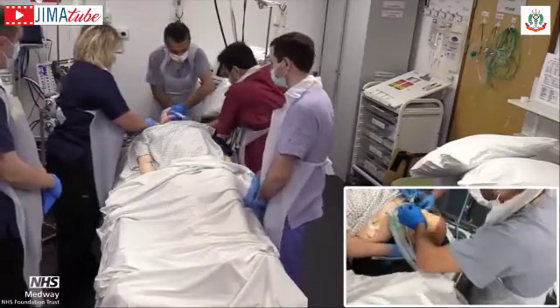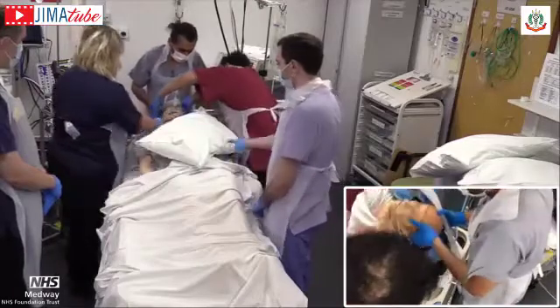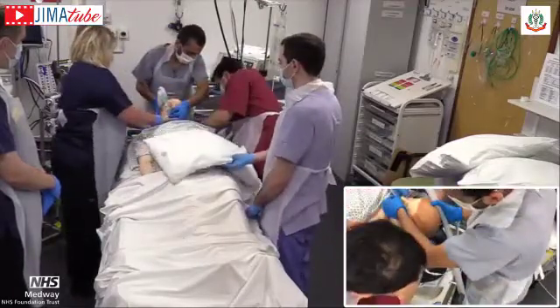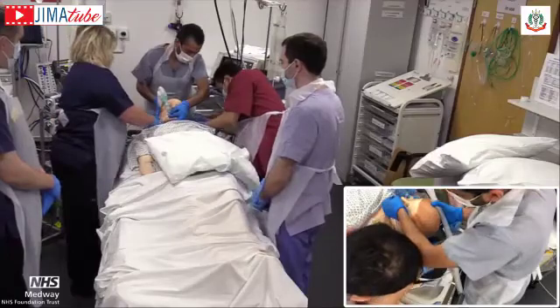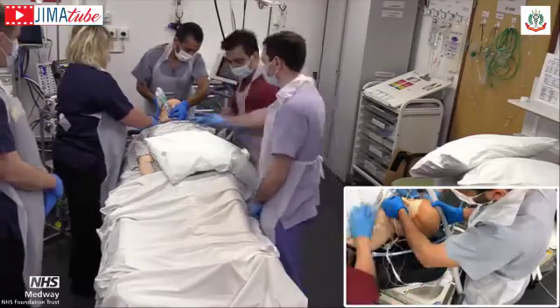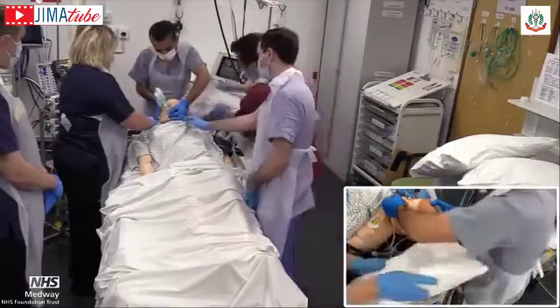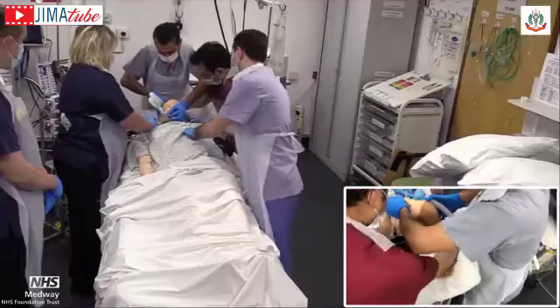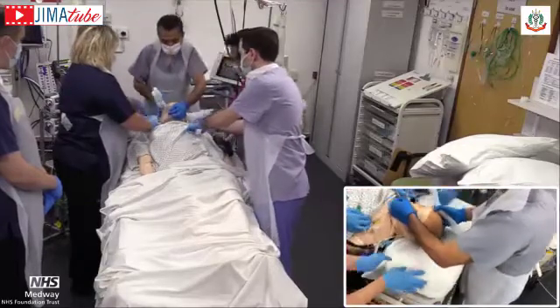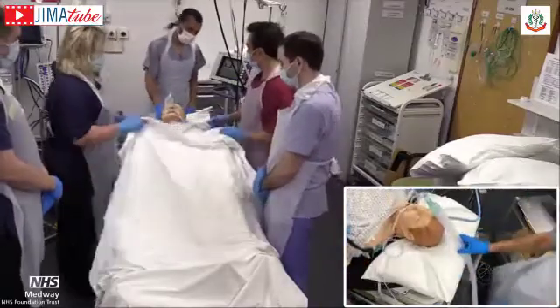So we must clear the central line and other tubings from underneath him. So if you hold so that it doesn't come in. Perfect. Okay, is he stable? Yep.